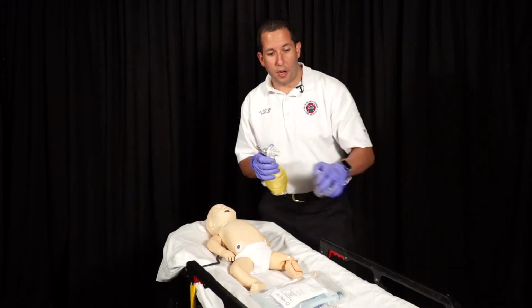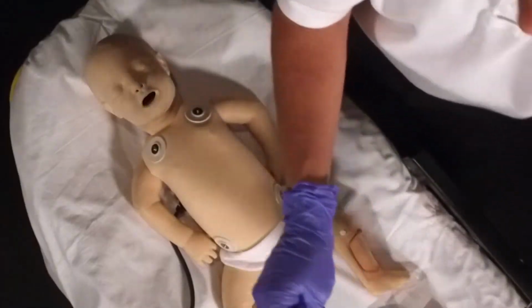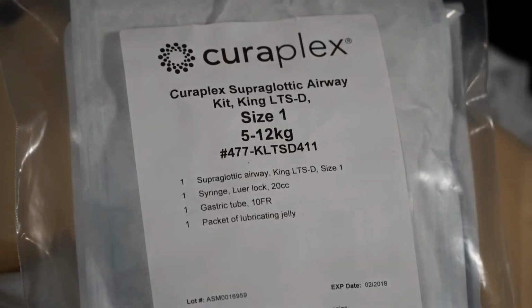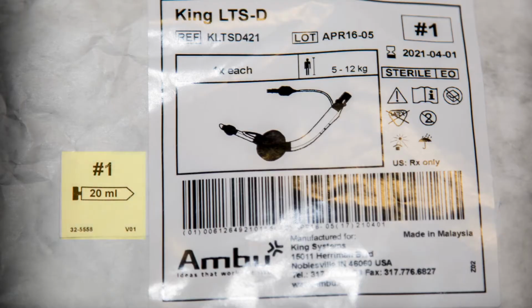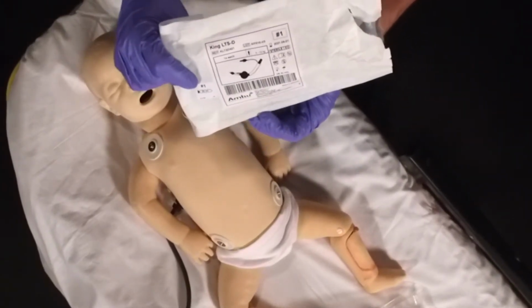The breaths go in, and now I'm going to be prepared to go ahead and insert my King Airway. Opening the package, in case you didn't see it on the app, again, the only way to determine how many mLs of air have to be inserted into the tube is on the outside of the package. So I look, I have a size 1, and I'm going to be inflating 20 mLs of air.